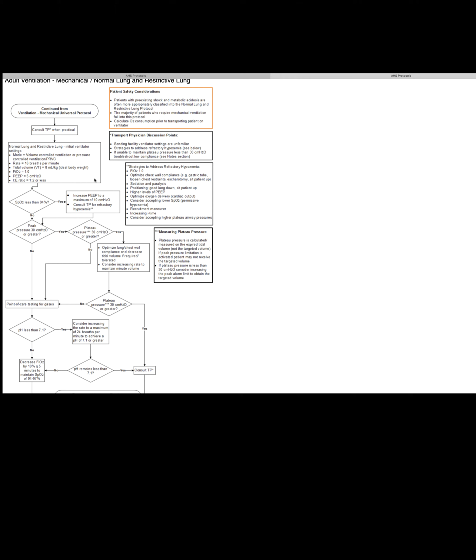But anyways, picking a rate, moving down. So rate, normal rate, 16 breaths per minute, 8 cc's per kilogram of ideal body weight. On the Hamilton, it's got a real nice feature that after you've measured someone's length, you can just program that into the ventilator, pick male or female, and it'll calculate. For ours, we've defaulted it so that it does the math for us, and we come up with 8 mils per kilo without having to do too much math other than enter the patient's length.